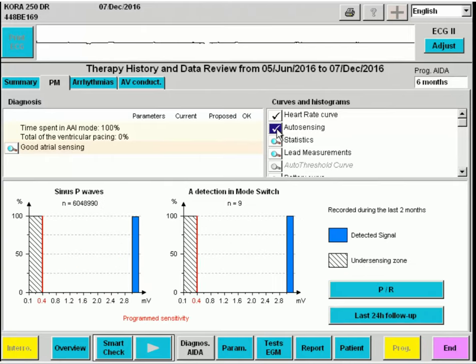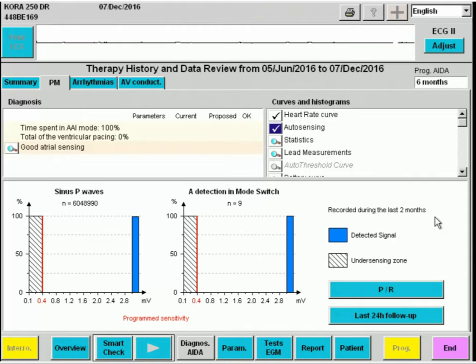Auto sensing will show the amplitudes of the sinus P-waves and of the P-waves during mode switch during the last two months. We observe that the amplitudes during sinus rhythm and during mode switch are much larger than the programmed sensitivity, shown here.